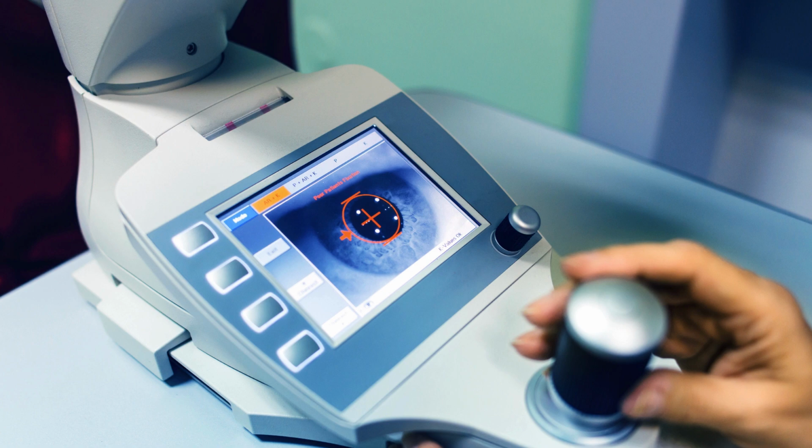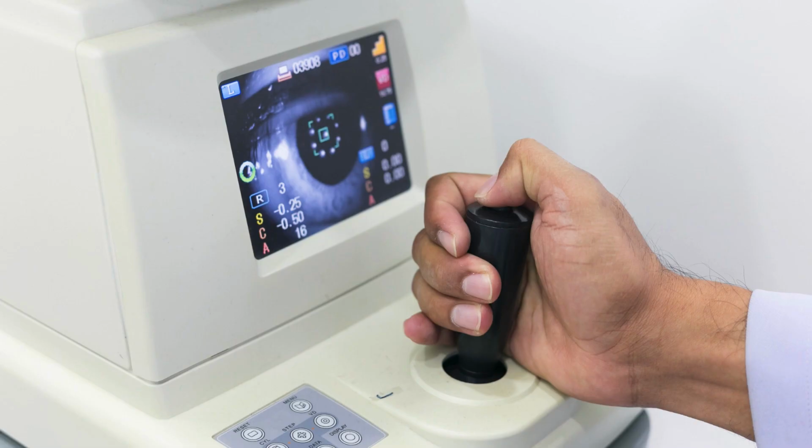For patients with corneal diseases, keratoconus, corneal scar, corneal dystrophy, and Salzmann nodules, corneal topography can evaluate the refractive effects of these conditions and aid in disease monitoring and surgical planning. Hard contact lens fitting: this test guides contact lens fitting, especially RGP rigid gas permeable lenses and scleral contact lenses.